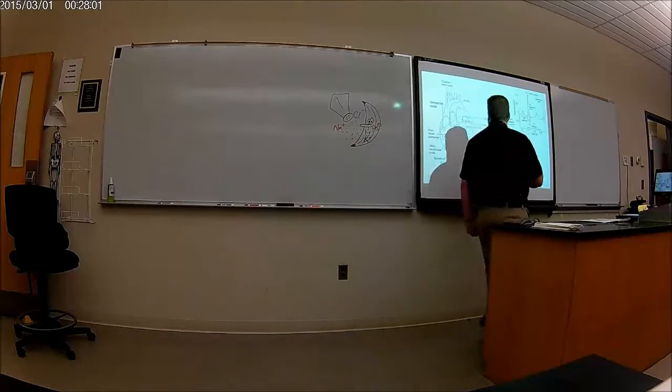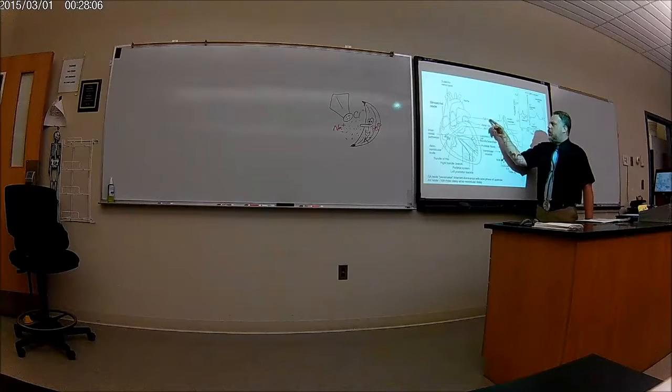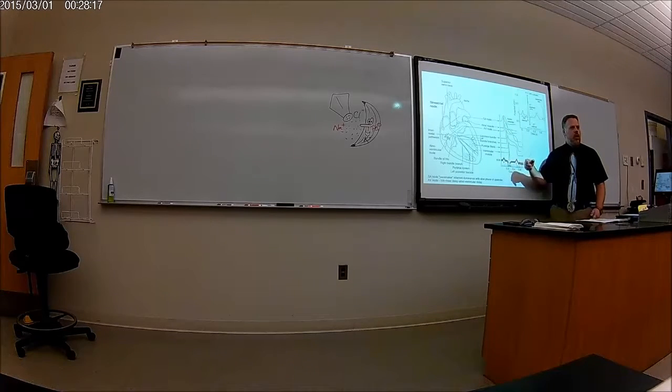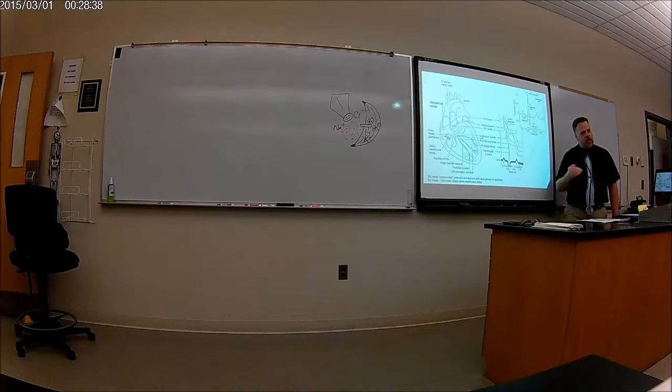So this is what it is. Your heart does all the action potentials. In the SA node, the action potential looks like this. The atrial muscle looks like this. AV node, it looks like this, and so forth. Those 12 leads are going to take all these action potentials and convert them into one conglomeration, this. This is all your action potentials in one picture called an EKG. Okay? And that's what we have to do now, is to talk about the parts of the EKG and what they mean. Does that make sense what this is?